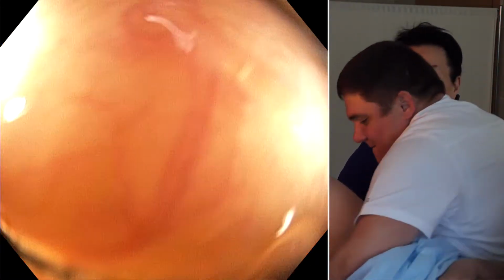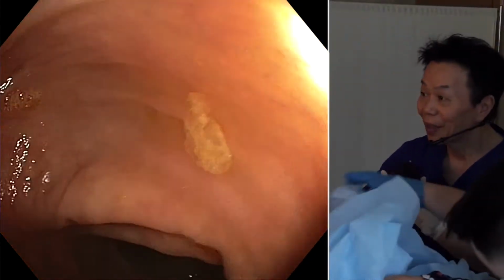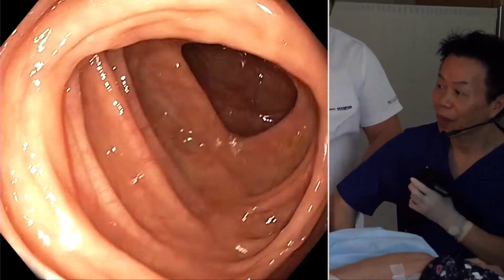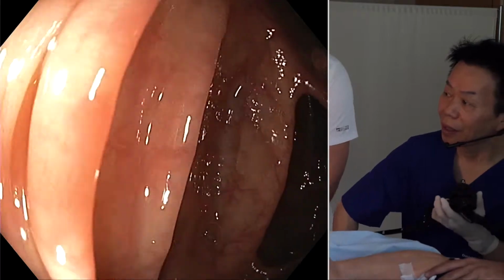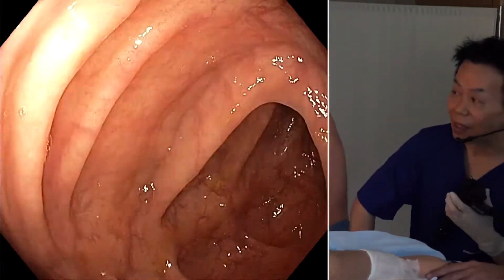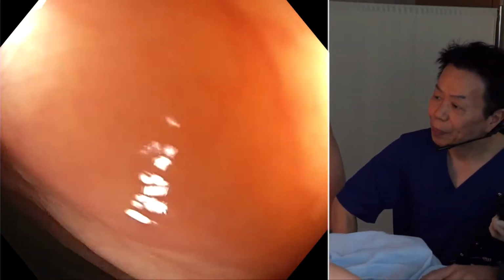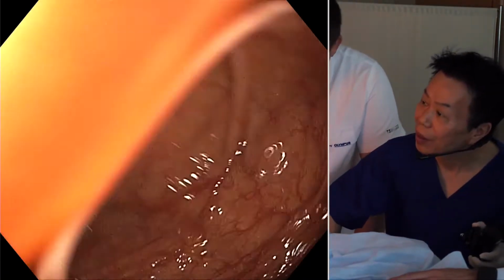So it's rather difficult to change position when the patient is sedated. Still, I feel some resistance. The sigmoid colon can be elongated very easily, so maybe I need hand pressure. Hand pressure. Yeah, wait a minute, wait a minute.